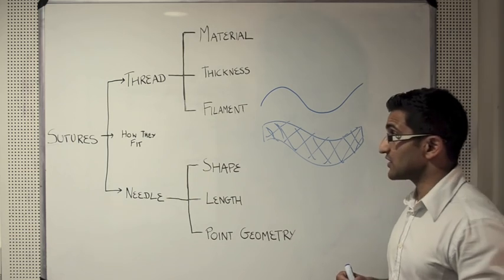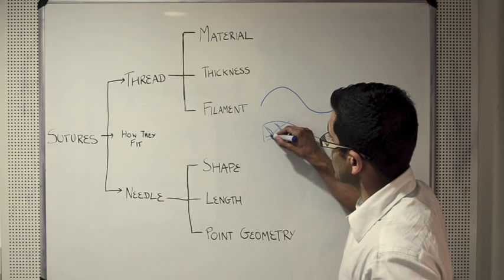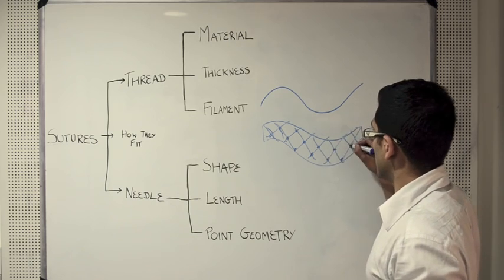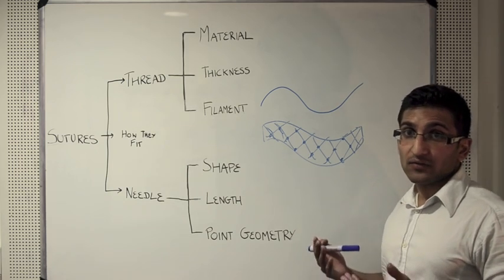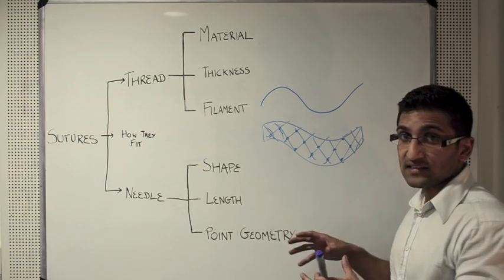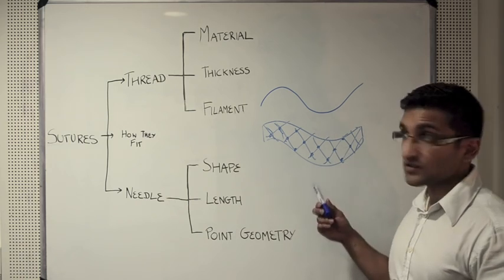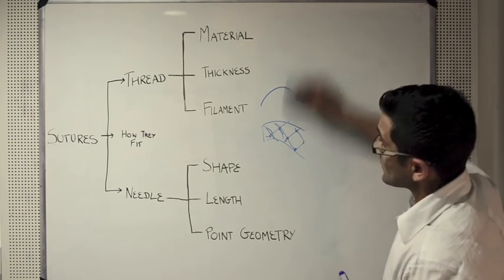However, the key disadvantage is the wick effect. And what this means is the areas where each filament overlaps, the small pockets where tissue fluid can accumulate. And as you know, accumulated tissue fluid on a synthetic medium is an ideal recipe for tissue infection, as microorganisms can settle in these areas and thrive in the tissue fluid. And that results in a greater degree of tissue wound infection with braided sutures as compared to the monofilamentous sutures. So that's everything you need to know about the thread.